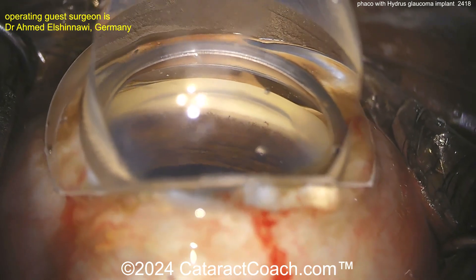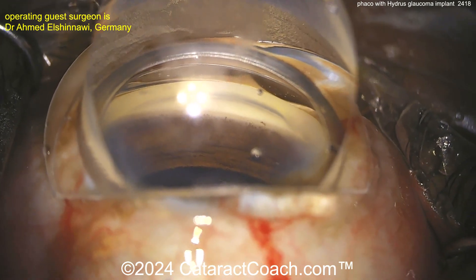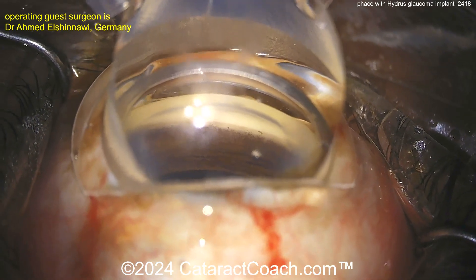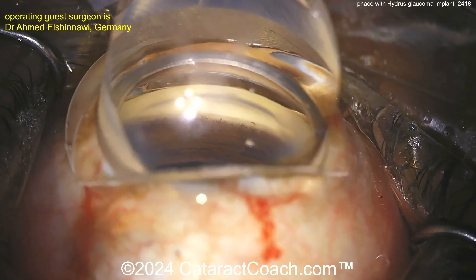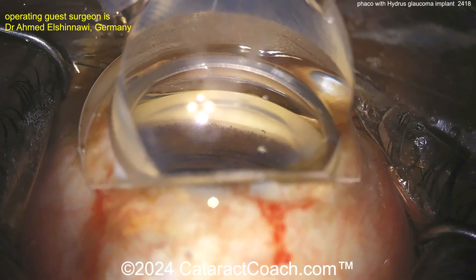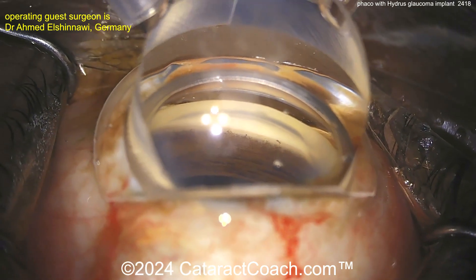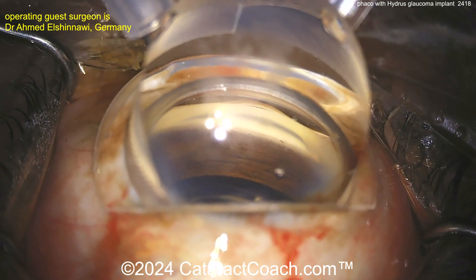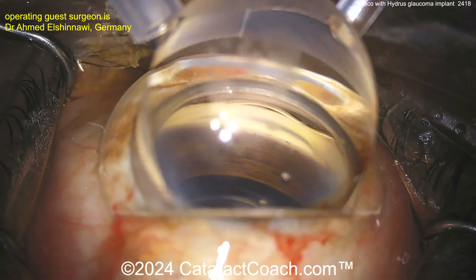Now you can insert your Hydrus device. Hydrus is a very popular device for MIGS — minimally invasive glaucoma surgery — and this is well within the realm of any anterior segment or cataract surgeon. In fact, studies have shown that most glaucoma procedures are done by cataract surgeons, not glaucoma specialists.